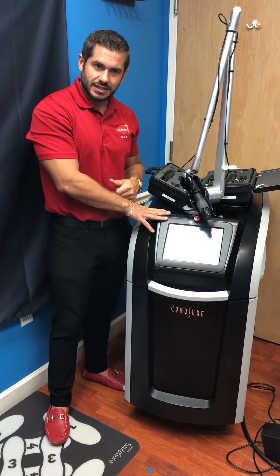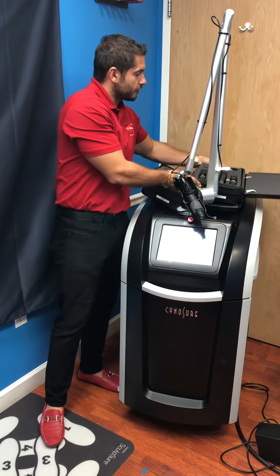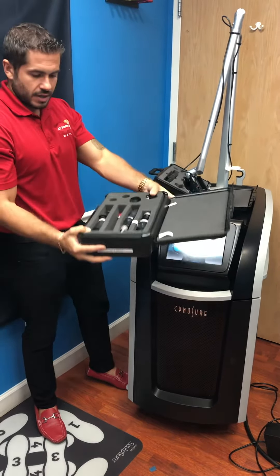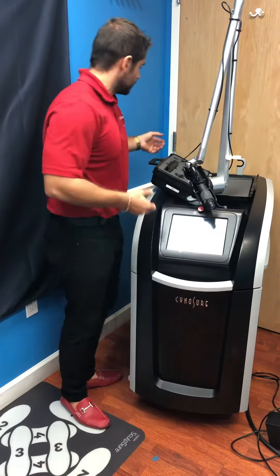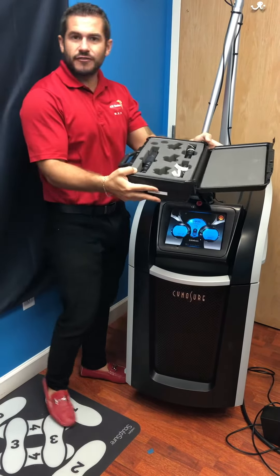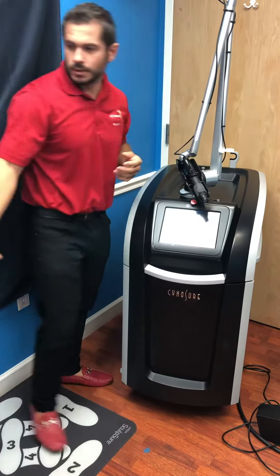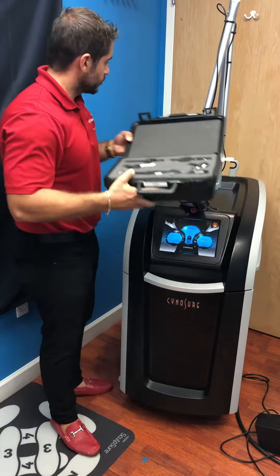This is a 2017 unit. It comes fully loaded with all of the different tips. It has the 1064, and it has the different attachments for skin rejuvenation. Here is the 532. These are all of the attachments.